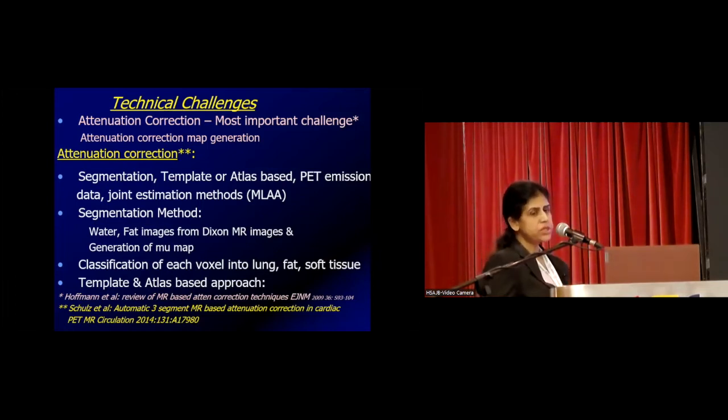So in the segmentation techniques, one needs to understand that there is a difference in the attenuation in the body tissue matrix, that is, water and fat have different attenuation coefficients. So we need to add counts to them to get a good quality image. Each voxel in the lung, fat and soft tissue has to be corrected so that we get a good image quality for interpretation.